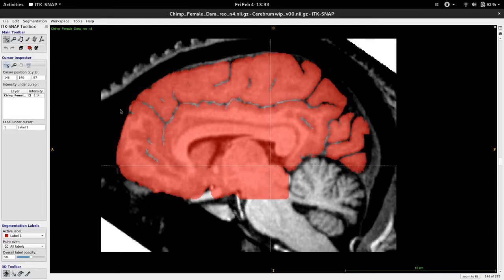I remove all this excess of segmented voxels from it. Okay, now I can start erasing. To make things faster, I'm using page up and page down to move across slices. I will segment every third slice, because after being done with this, I'm going to use a morphology operation, a little Python script, to get rid of the in-between slices easily. Okay, let's go.